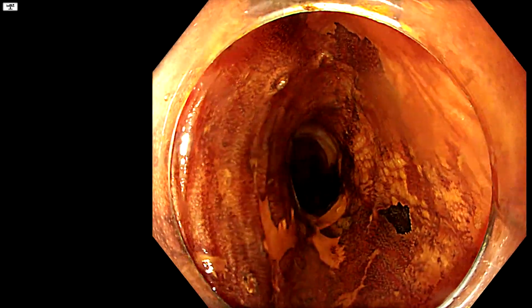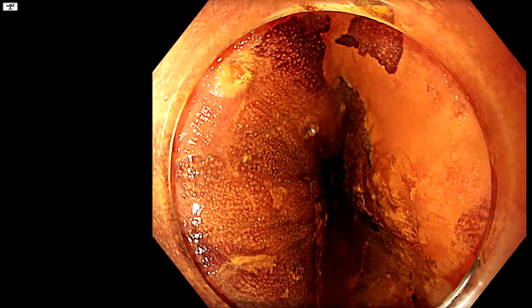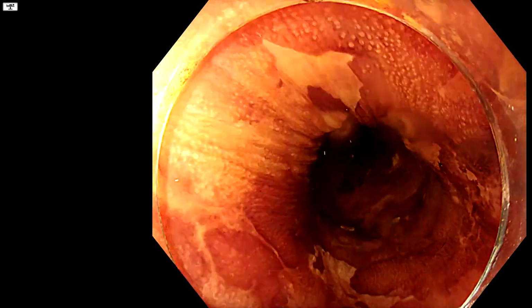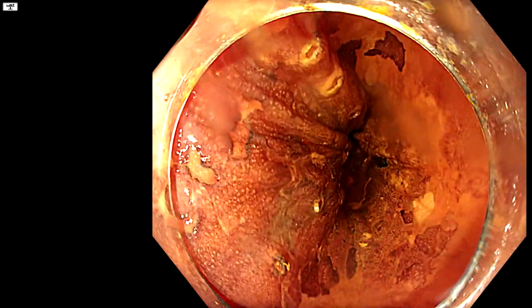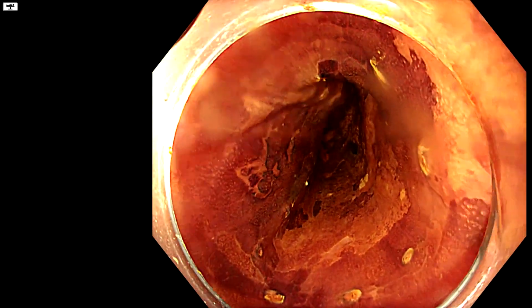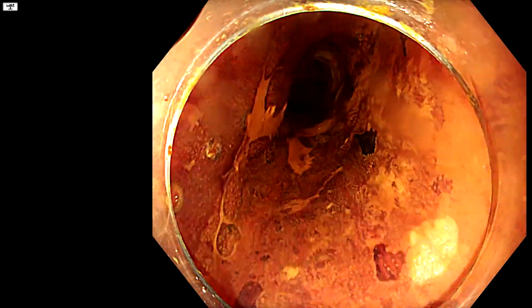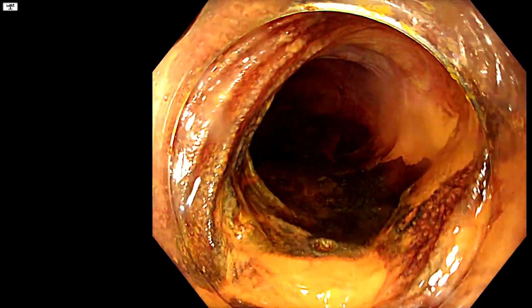Yeah. And then if you just take that image where you see at the 12 o'clock and the 6 o'clock that there is maybe 2 centimeters between the two, then you think, well, actually, maybe we should take the whole circumference. Anyway, I'll leave you in suspense. We'll stop the video. I'll leave you in suspense about what we actually do, but this is probably something interesting for you to see the complexities of doing this and the way that you can use both to get additive information. And I think AI will help us with this more in the future for sure.